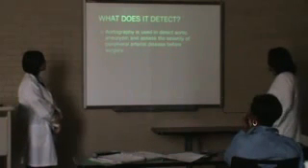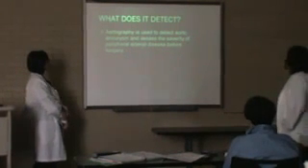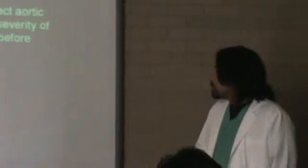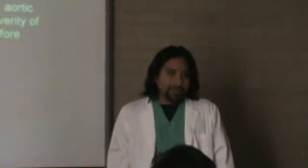I'm sorry, what it detects. Aortography detects aortic aneurysm and assesses the severity of PAD, which is peripheral arterial disease. Now those things are important, and this is before surgery. They're important because they tell your physician the kinds of treatment that he is going to be giving you, and it also gives them information about your heart, what it's doing, how efficiently it's pumping blood, and also the kind of pressure that's building up in the blood, in the heart.